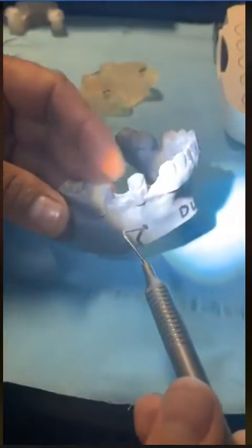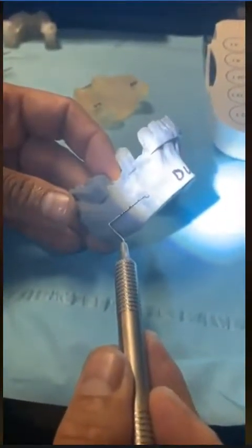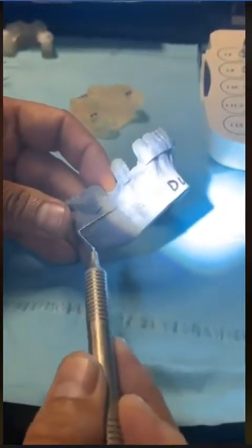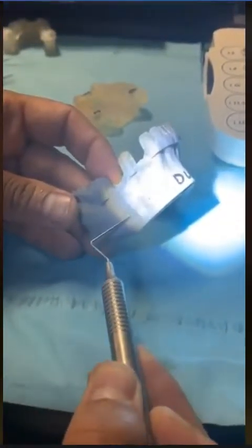And here is another, the mental foramen coming out through here. One indication of a mental foramen is that the nerve is never above the mental foramen. Generally speaking, it's either aligned with the mental or below the mental.